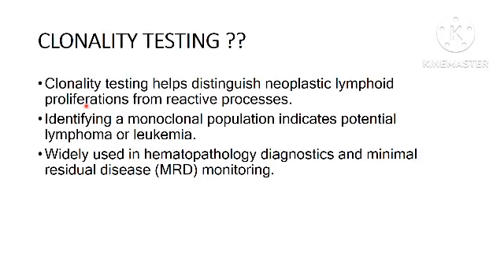So why do we do clonality testing? Clonality testing, as we have just seen, helps to distinguish neoplastic lymphoid proliferations from reactive processes. It identifies a monoclonal population which can indicate a potential lymphoma or leukemia. And clonality testing can also be used for monitoring your residual disease.